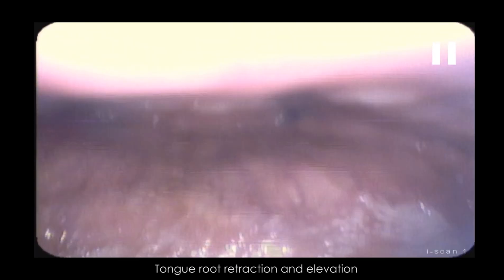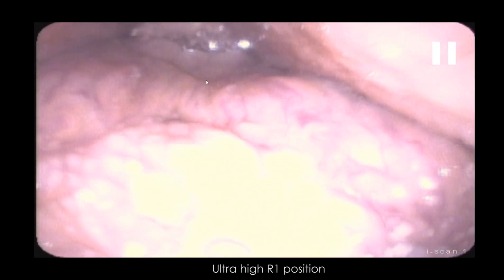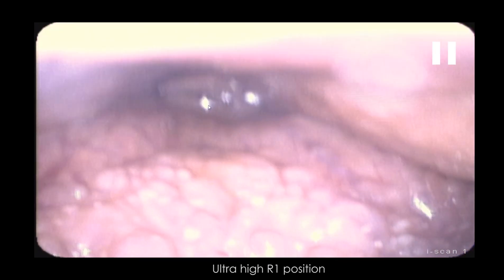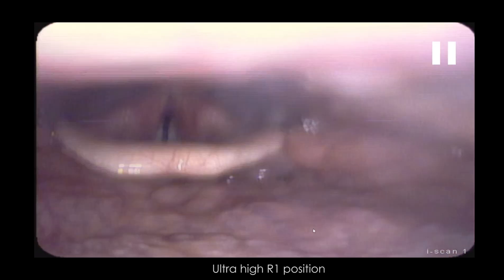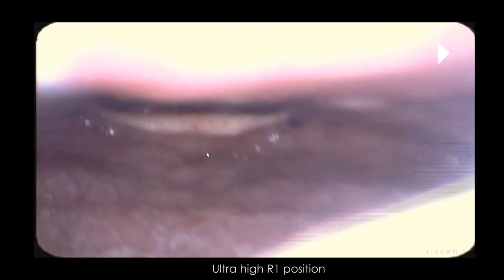We can actually see the tongue root retract. I think I talk here, and you can actually see how when I speak — oh, this is actually really, really feminized, it's like a really, really tiny structure. So there's a word — let's look at the word 'awesome': ah, ah, ah. I had a camera down my throat but look at my tongue retraction here.